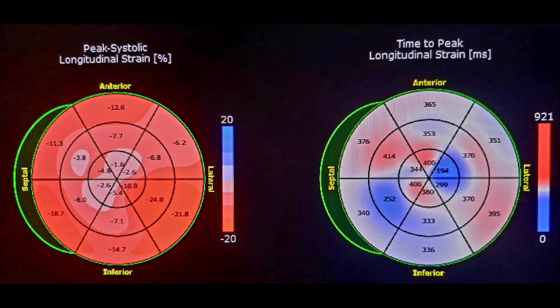This is a GLS. Ignore the one on the right, the left. So from the GLS, what do you think? Not really good. So it tells you already, not really good. Something is wrong. My measurement is okay, but my GLS is still pink and white.